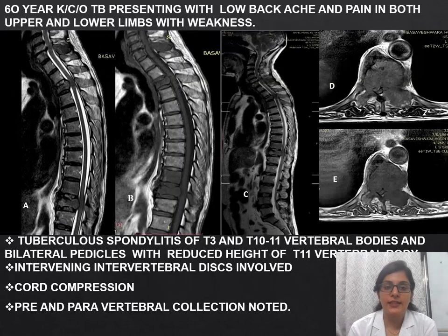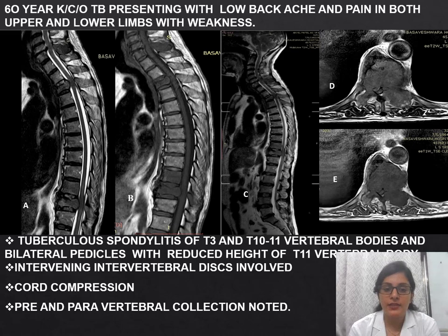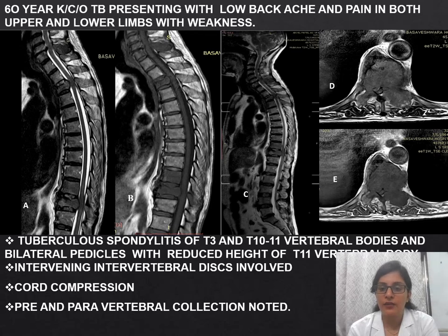Next patient: a 60-year-old male, known case of tuberculosis, presenting with low backache and upper and lower limb weakness. MRI shows tuberculosis spondylitis of T3 vertebral body and T10 to T11 vertebral bodies, with bilateral pedicle involvement and reduced height of T10. The disc is also involved, leading to cord compression, and there is pre- and paravertebral collection.